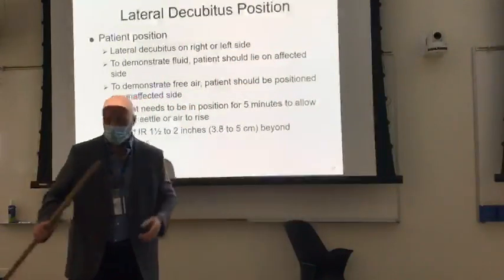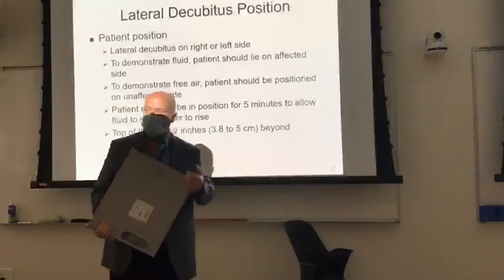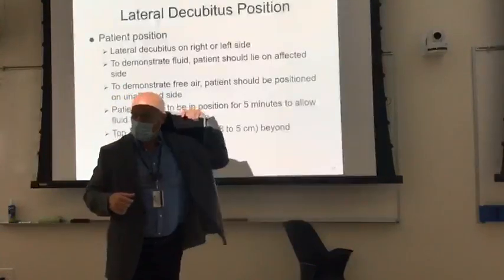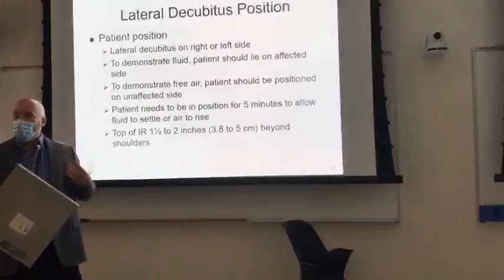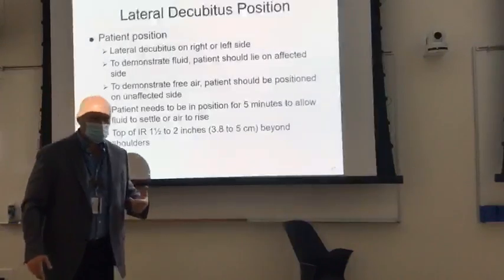And then what we're going to do is put the image receptor either in front of the patient, so I'm laying on my side, and shoot PA, or put it behind the patient and shoot AP. Okay? It doesn't really matter if you shoot AP or PA. In my experience, it's better to shoot AP than PA.